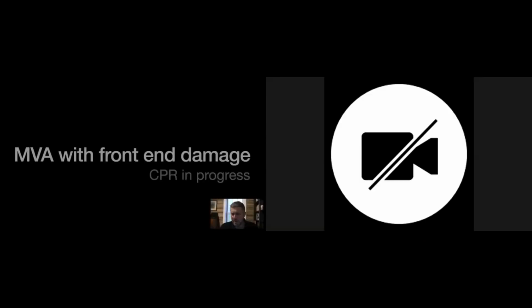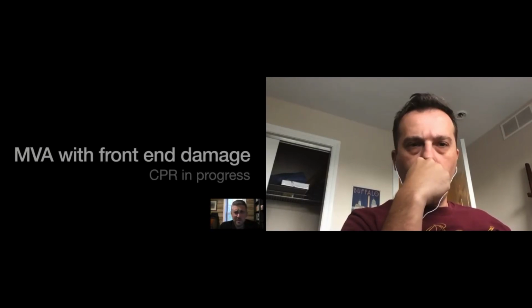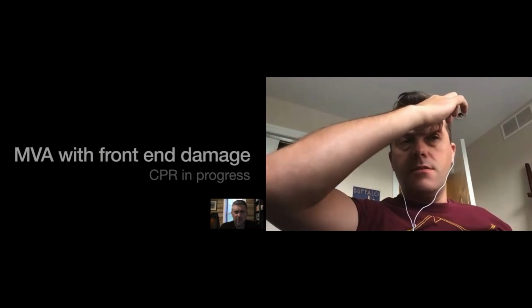And my gut, and Dan Mersch, you can chime in here if you have a number and a PubMed reference, but my gut is that ultrasound is going to perform pretty well, because ultrasound can definitely identify a smaller amount of fluid than chest X-ray can, particularly in the supine patient. I think, to me, it makes sense. Talking about hemothorax? Yes, hemothorax.